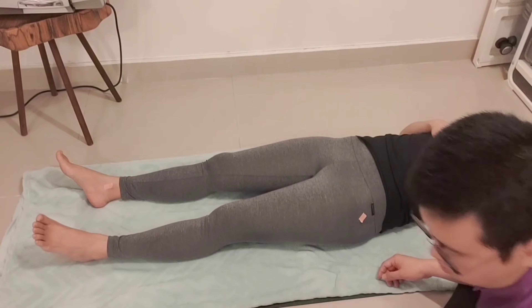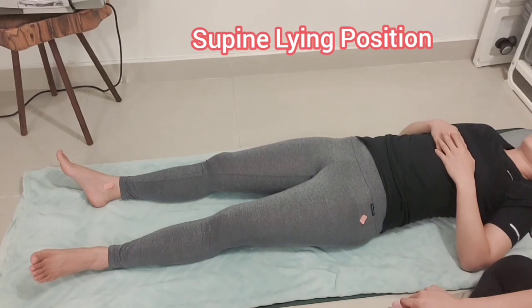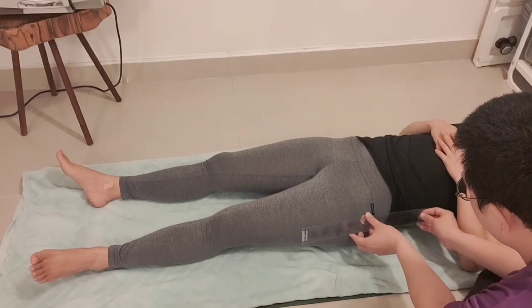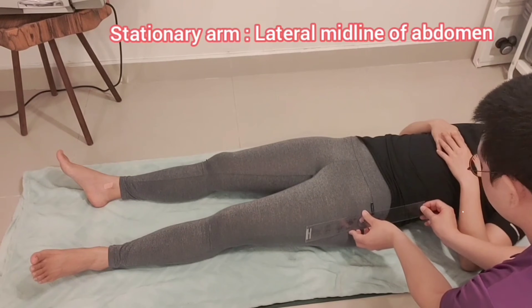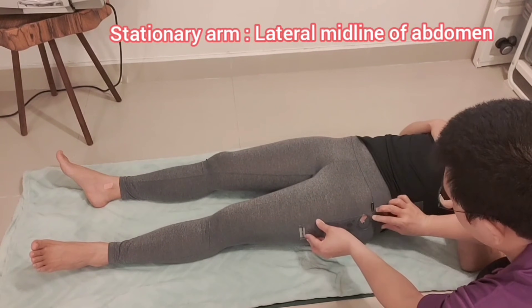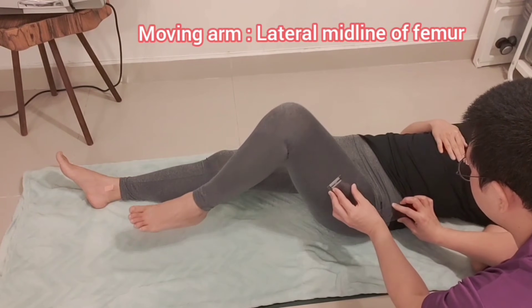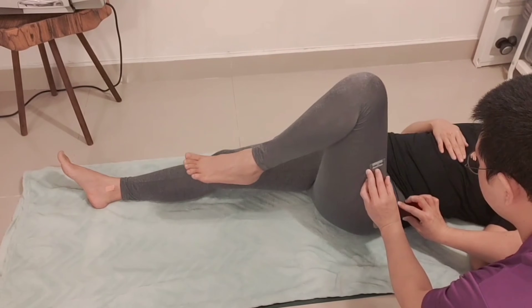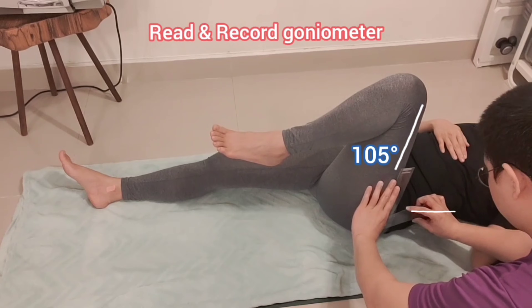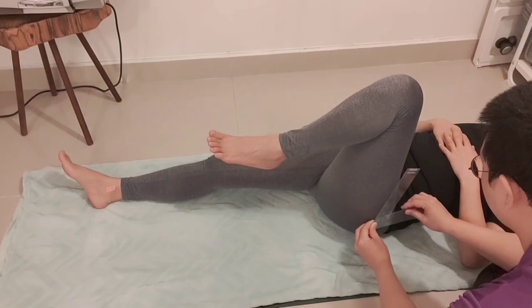During the hip flexion range of motion, place the patient in the supine lying position. We attach the sticker at the fulcrum point. The stationary arm should be at the lateral midline of the abdomen or pelvis, and the moving arm should be at the lateral midline of the femur. We read the goniometer to check the result and record the measurement.